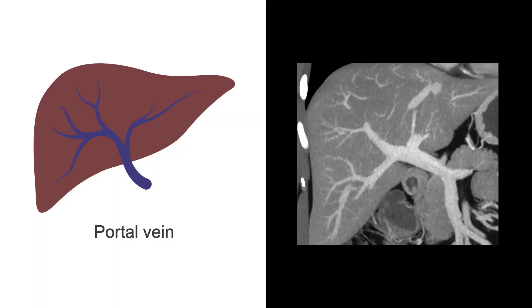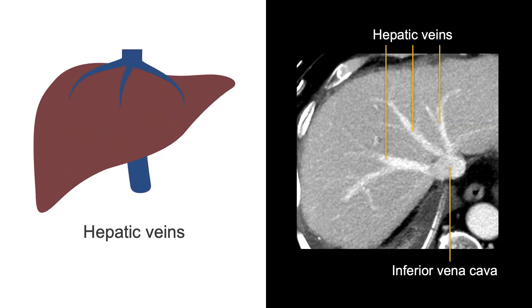When evaluating the liver vasculature, you should first check the portal vein and follow it into the liver as it splits into the right and left branches. In portal venous phase CT, the right, middle, and left hepatic veins are usually filled with contrast mixed blood and can be seen emptying into the inferior vena cava, which is found along the back side of the liver.